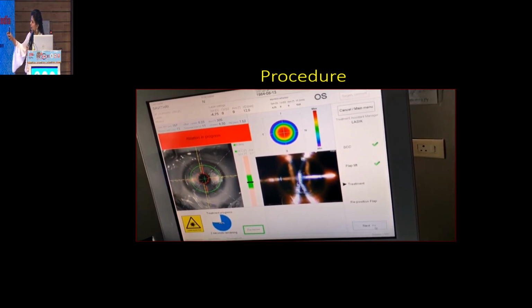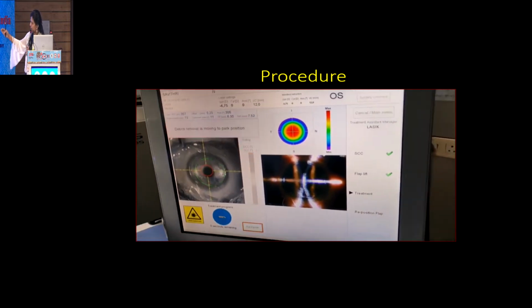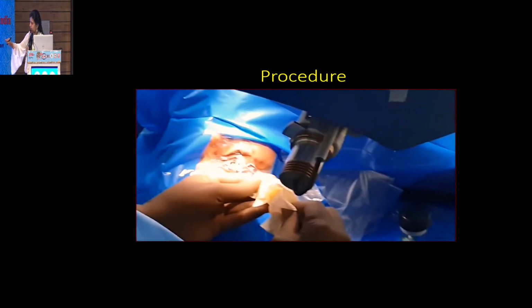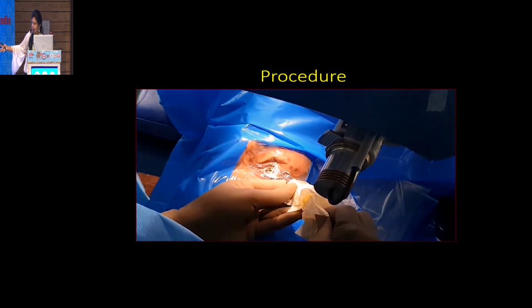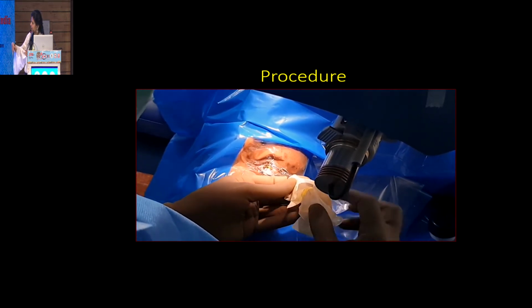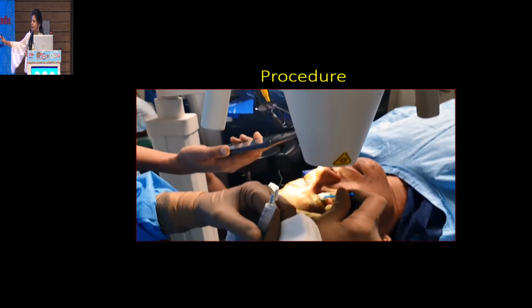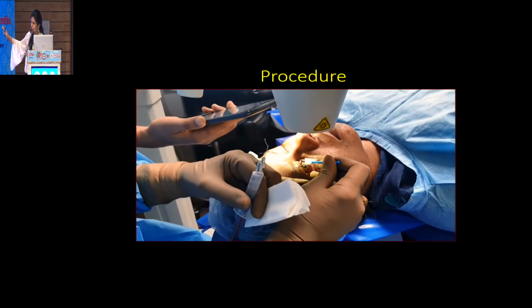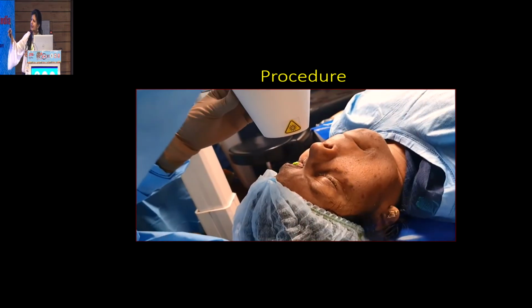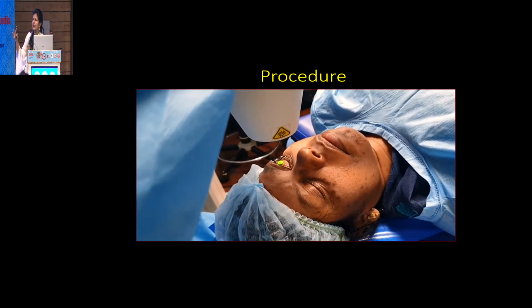from the procedure of infiltration by riboflavin. Once the treatment is done, you put riboflavin on the bed of the flap and spread it, and put the flap back, so that whatever absorption of riboflavin happens is into the stromal bed. This is the classical protocol described by Kanellopoulos. He was one of the first to do the procedure. You take out all the excess riboflavin and then irradiate that part of the cornea for a short duration.